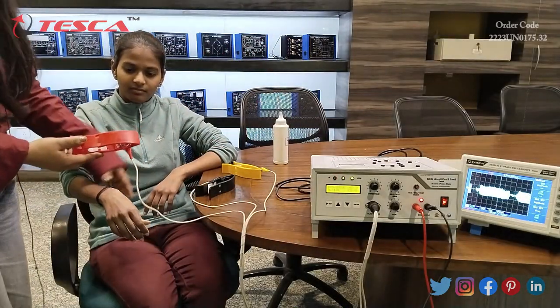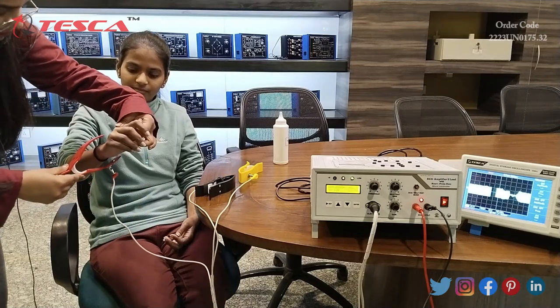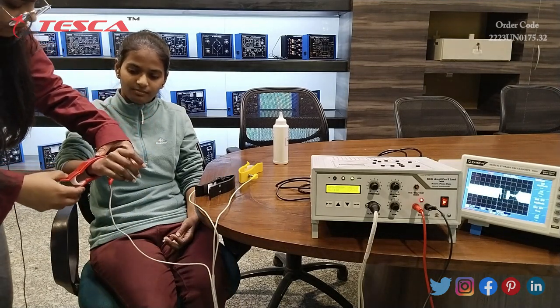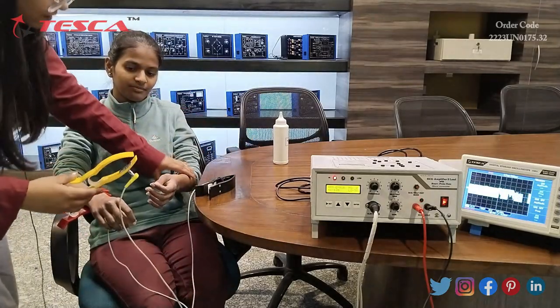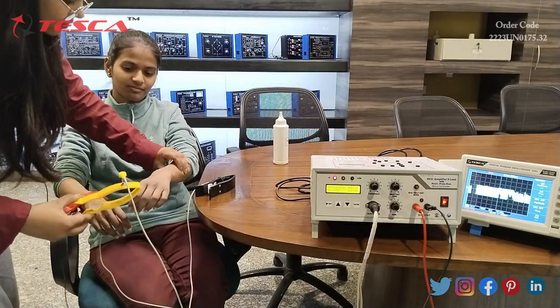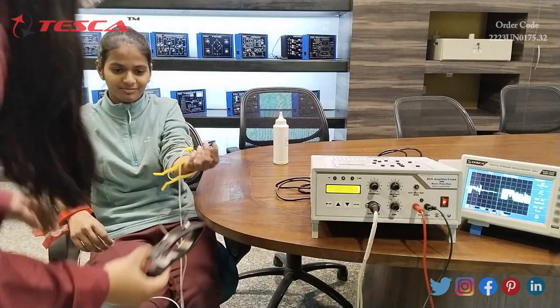We apply the red clip on the right hand, the yellow clip on the left hand, and the black clip on the left leg.